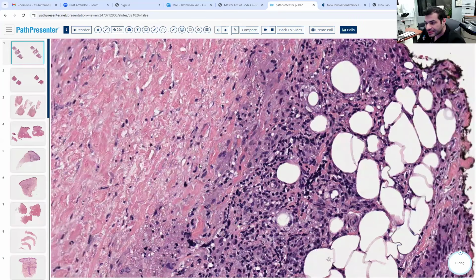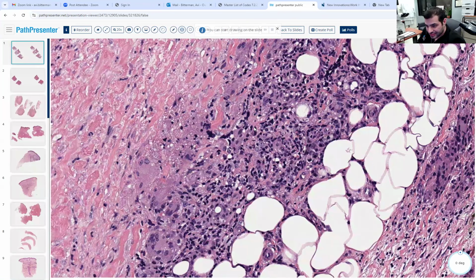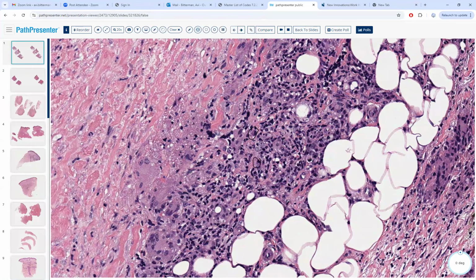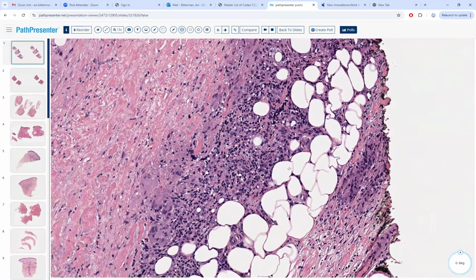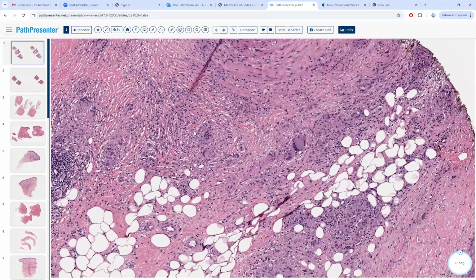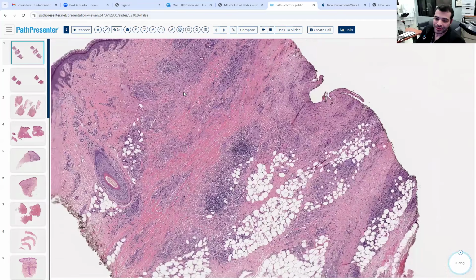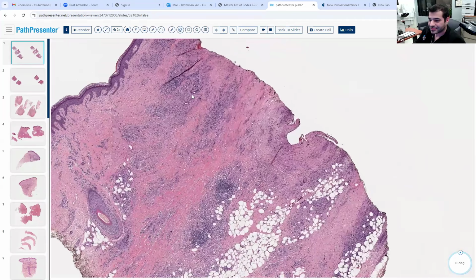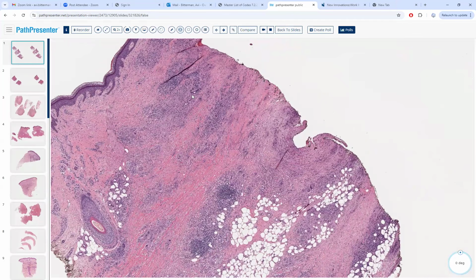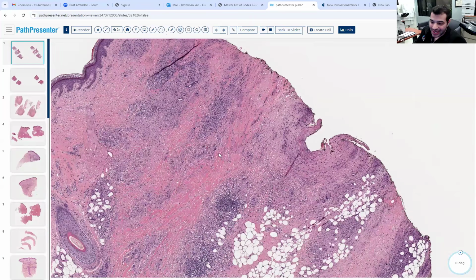What kind of cells are these, for example? Those are plasma cells, and we see those more commonly on the shins, which is where you see NLD. So it's more common to see plasma cells in NLD than GA. Good. What if we were to throw a colloidal iron on this? There's going to be more mucin in GA. It's more common to see mucin in GA than NLD. Okay, you guys got it.